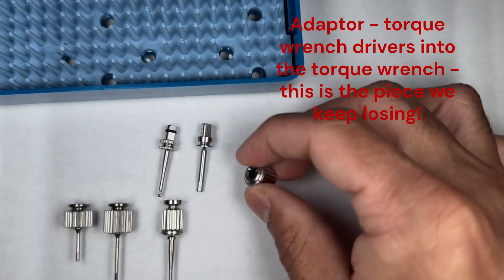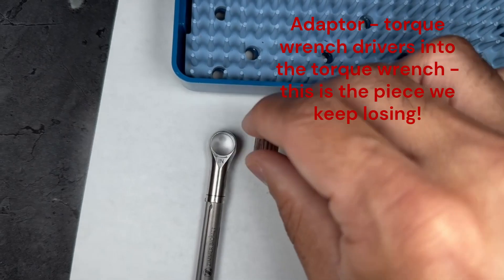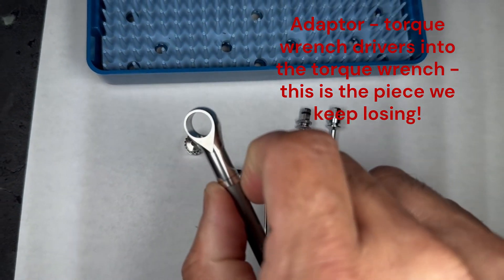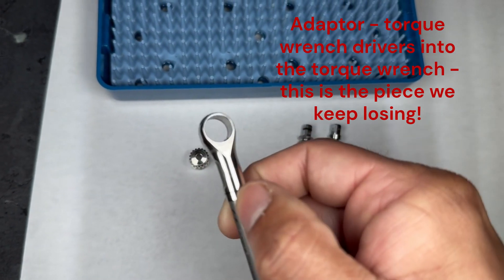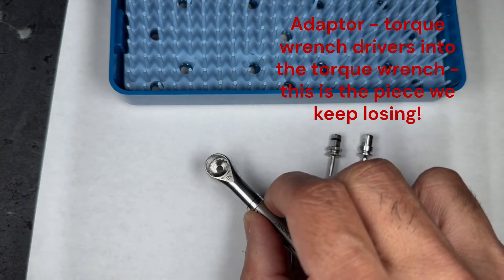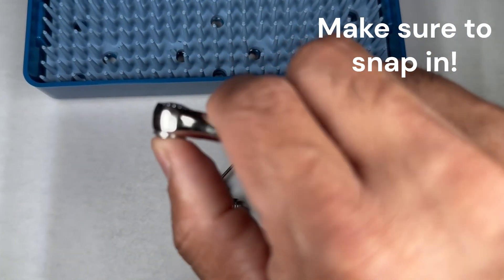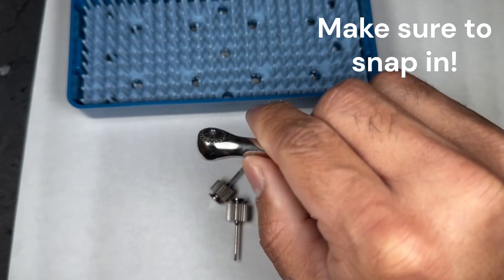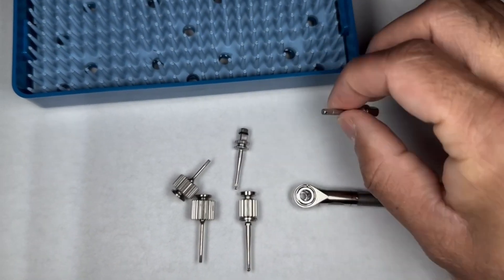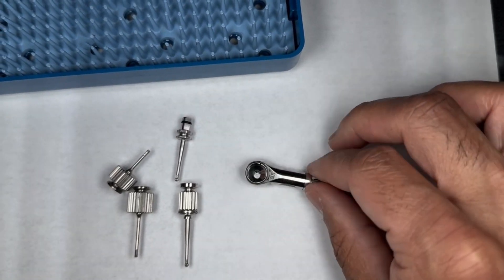The last piece is the actual connection adapter for the torque wrench. This goes inside the wrench — if you want to retract it you keep it on the inside, if you want it extended you bring it to the outside. This should snap in like that. Now you can go ahead and put whatever driver you need — most likely this one — when it's time to torque test the implant.